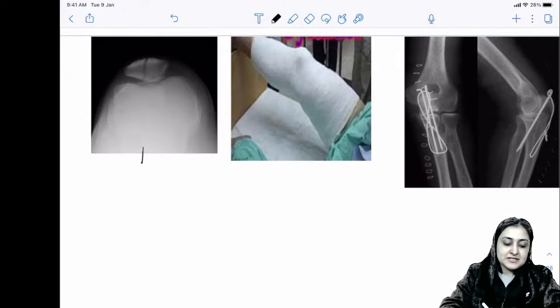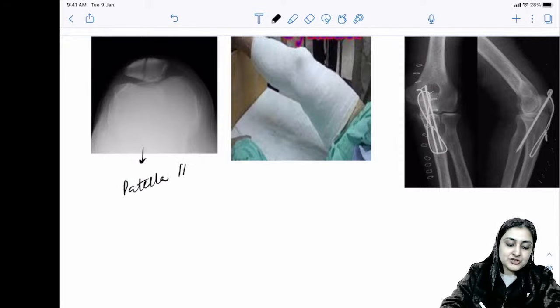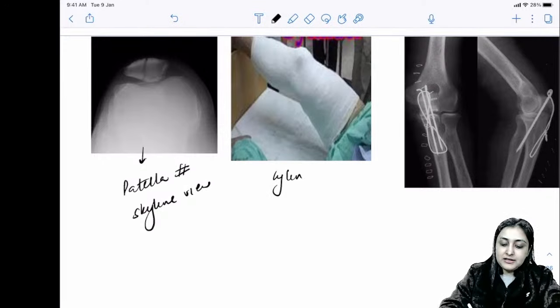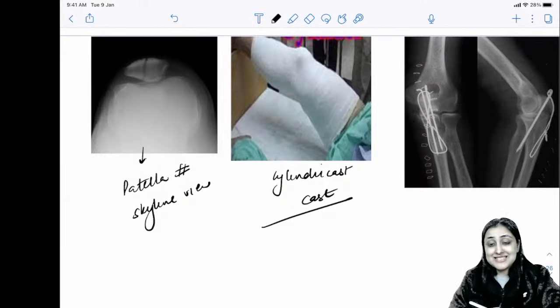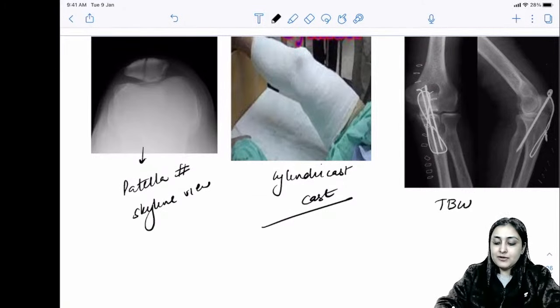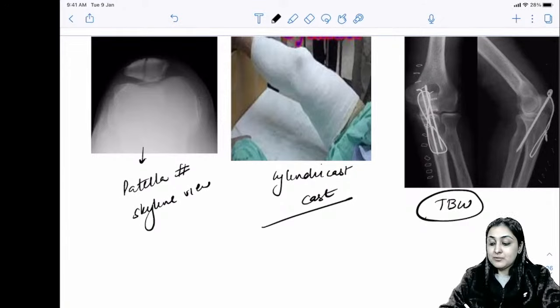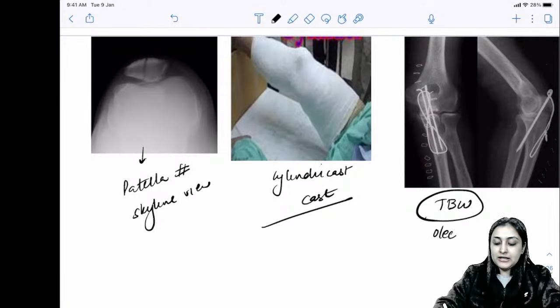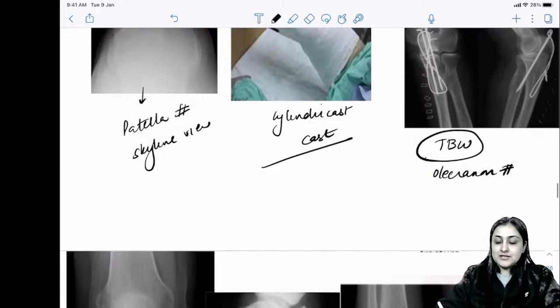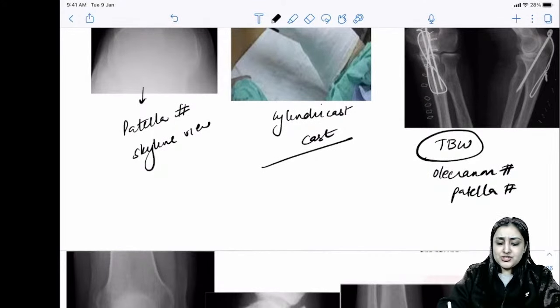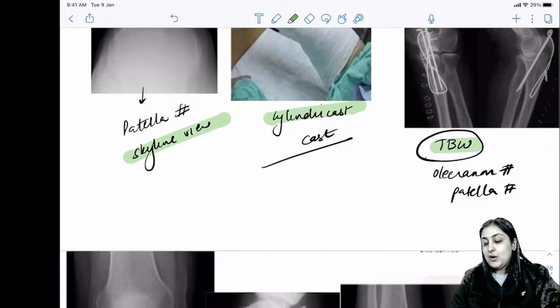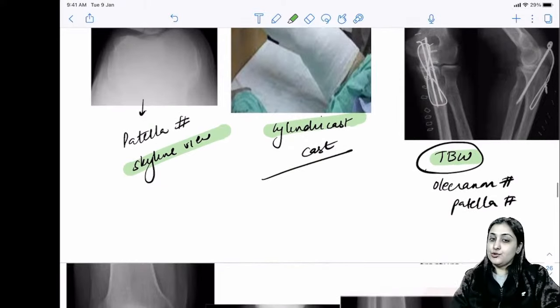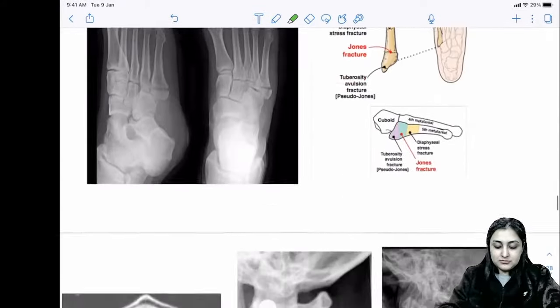Patella fracture is viewed on skyline view; management uses a cylindrical cast. Fixation is done with tension band wiring. Two locations for tension band wiring: olecranon fracture and patella fracture.